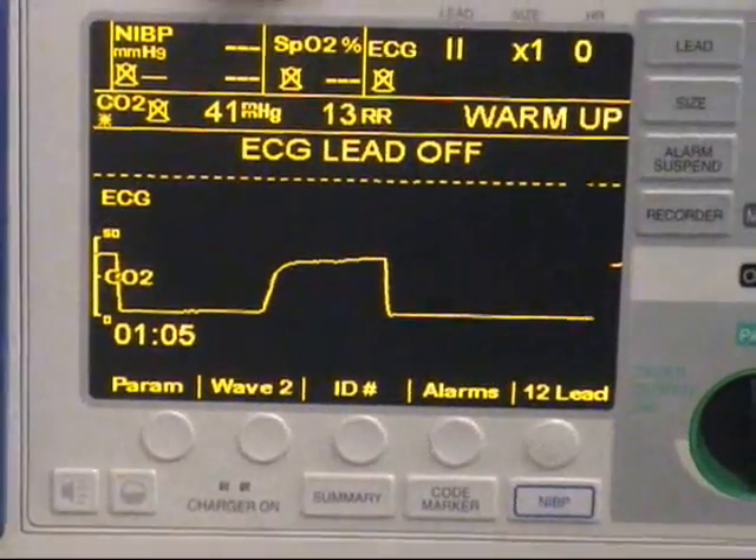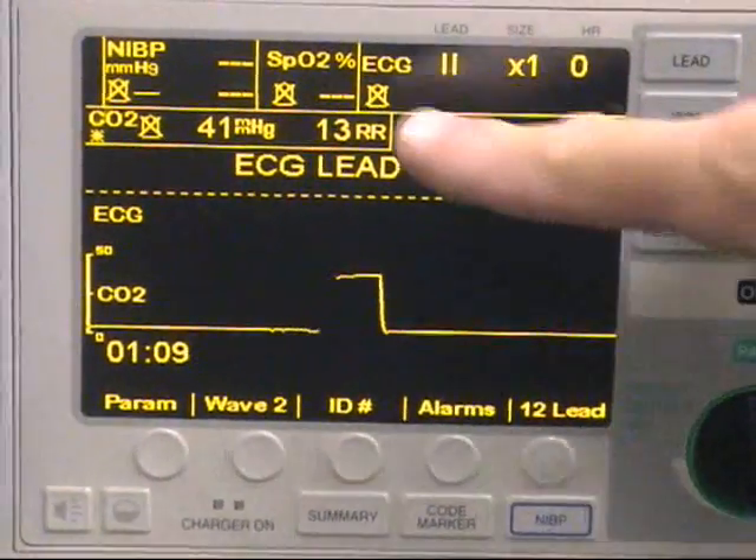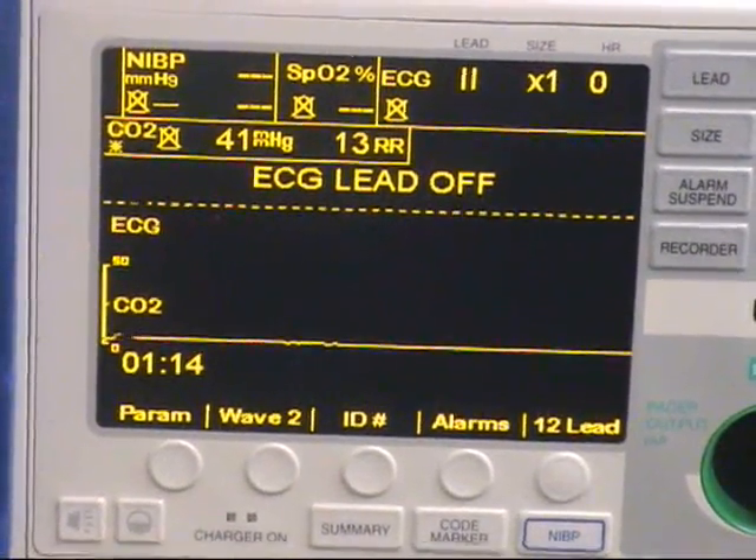As you can see, we have an end-tidal value of 41 millimeters of mercury and a respiration rate of 13. Now that the warm-up message has gone away, you'll just continue to monitor end-tidal CO2.